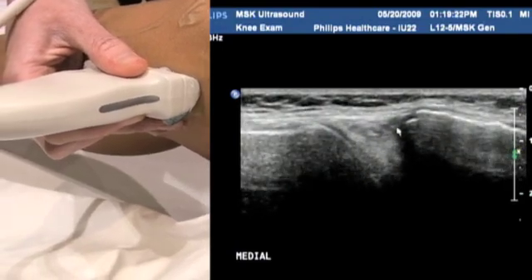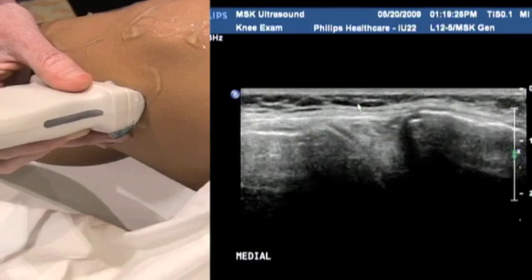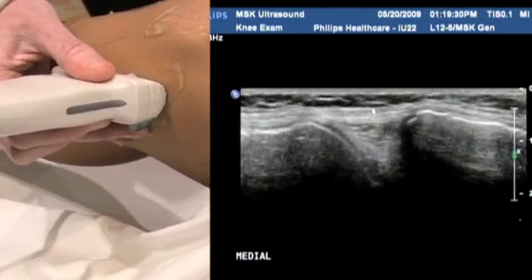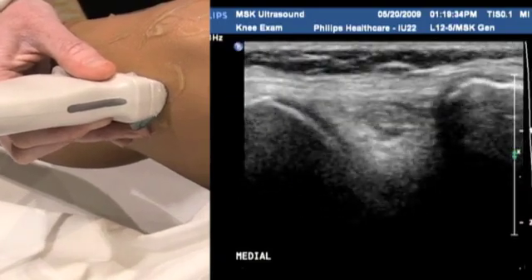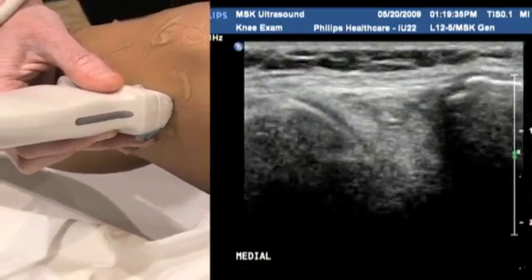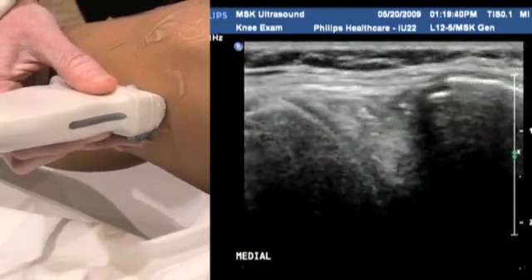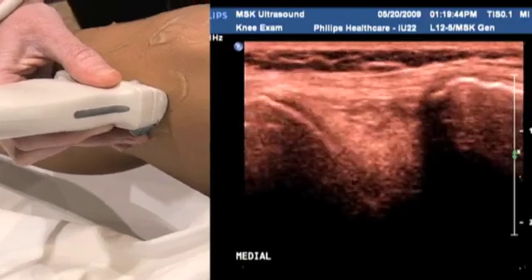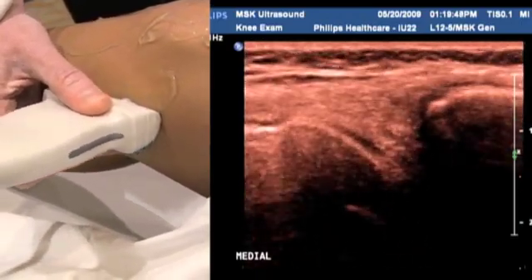Sometimes the meniscus will want to come right up and above the bony structures of the knee, abutting the sub-Q fascia here. And that's something that's considered abnormal. Again, be sure to really zoom in on the meniscus as much as you need to. Using the HD zoom is ideal. And again, be aware that the chroma is something that may help you in your assessment of the meniscus.